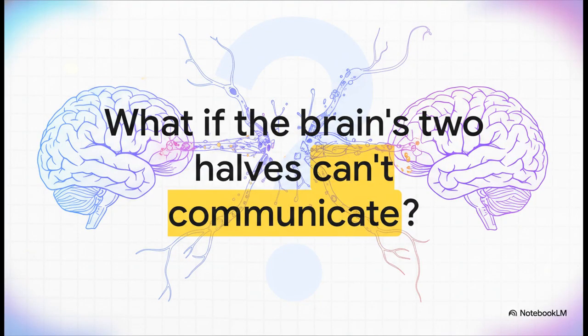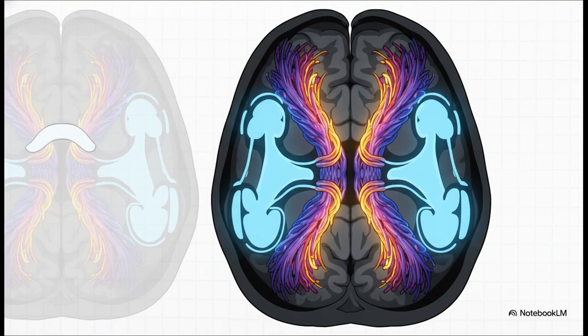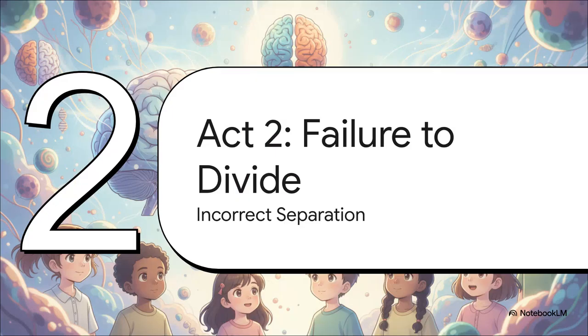So that brings up a really interesting question. What if the brain's main information superhighway, the thing connecting the left and right sides, was just missing? Well, that leads us to a classic example, a condition involving the corpus callosum. You see, without that corpus callosum bridge, the nerve fibers that are supposed to cross from one side to the other literally have nowhere to go, so they just pile up along the center. These pile-ups are called Probst bundles, and they physically push the brain's fluid-filled chambers, the ventricles, apart. This creates these really distinctive shapes that radiologists can spot, like steer horns from the front or a racing car from above.